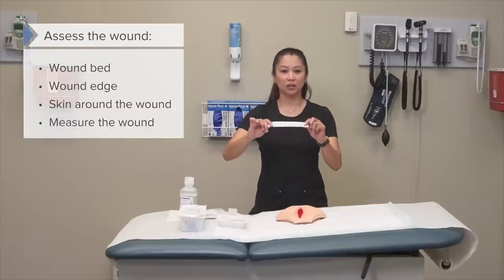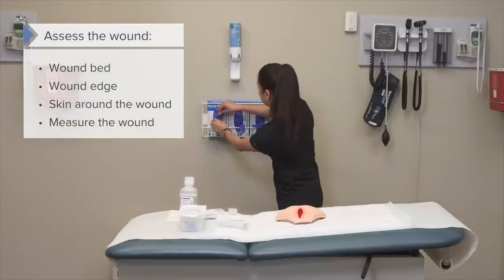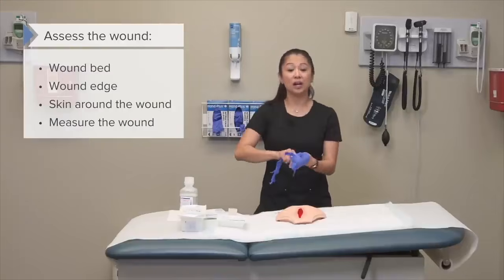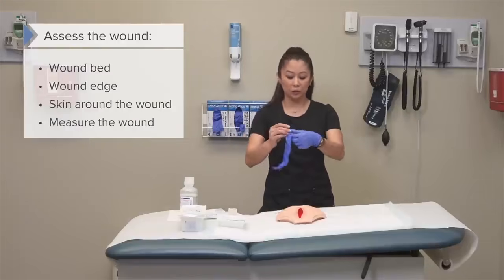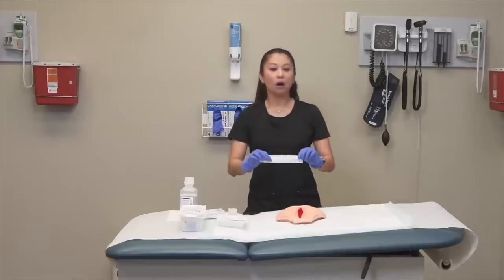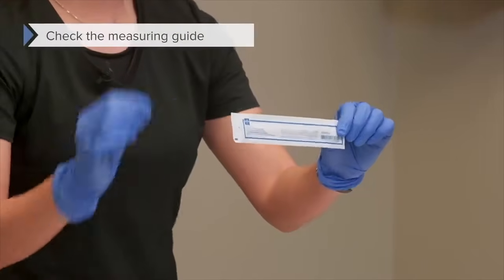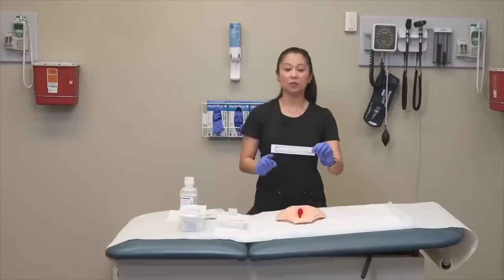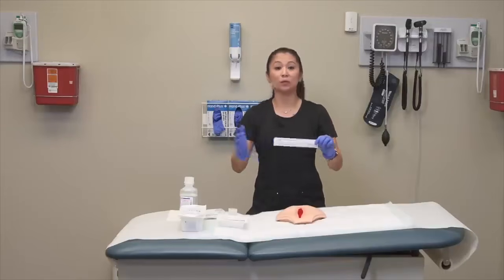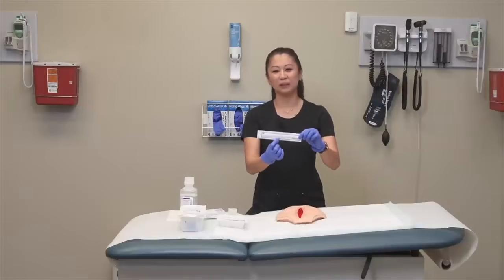So I want you to take a look here. Because I'm going to measure, I'm going to go ahead and put on my gloves. And many times you have cotton tip applicators that are sterile on your unit. This is a great device to use because it's sterile. Also, I want you to note that there is a measuring guide on top of here, so it makes it really easy. Now, sometimes there will be just a separate paper tape that's disposable that your facility may have, so you can grab that as well. But if you can't find one, there's one here on the cotton tip applicator for you.